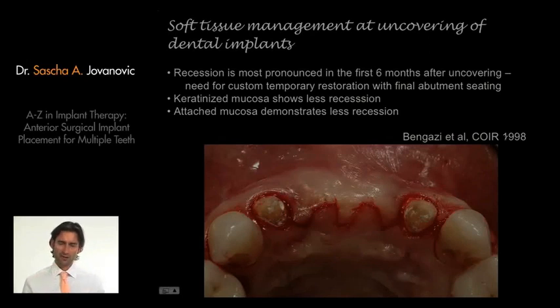So there's a lot of discussion which can be had here. I'm going to focus here to really use the example of one patient to demonstrate some of the flexibilities we have. Again, there's two goals we have. First goal is to increase thickness of soft tissue. And secondly, to increase keratinized tissue.